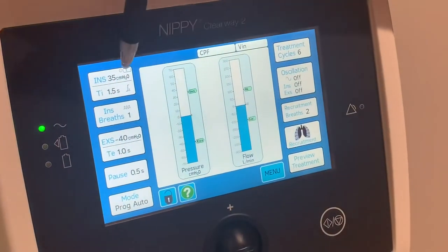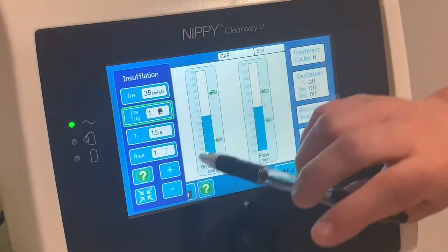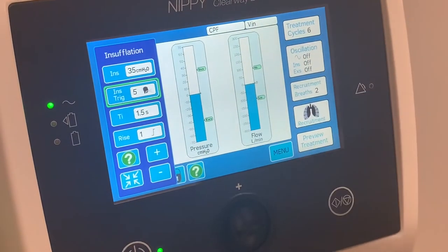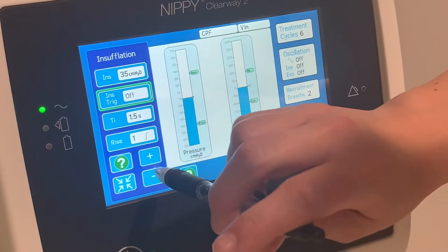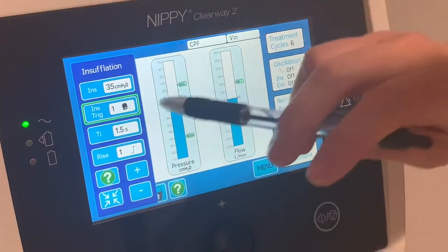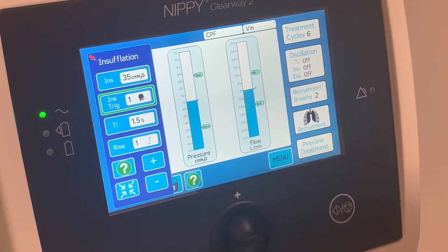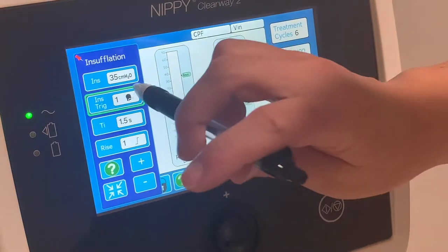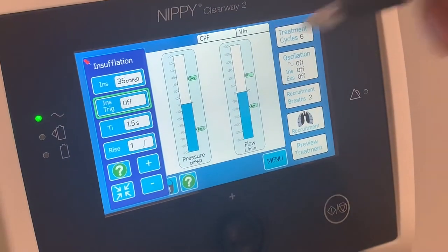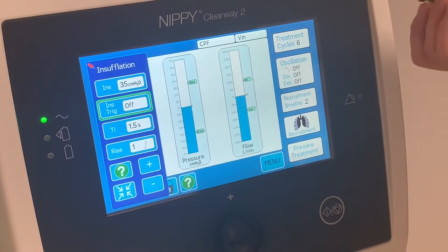In program auto, you have your inspiratory breaths shown at the top — I've set it to plus 35. There is a trigger which can go up to 10, and this is a lot more sensitive than the previous Clearway. Even with paediatrics on a triggered auto of 1, they tend to trigger it really well. For ICU patients who are sedated and ventilated, you need to turn the inspiratory trigger off so the machine does it for you.